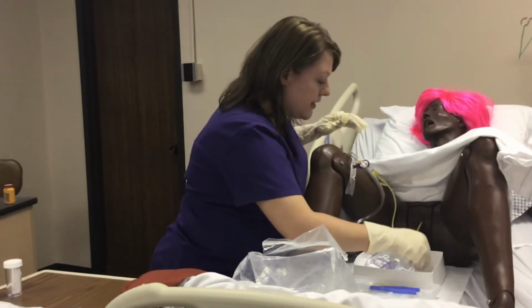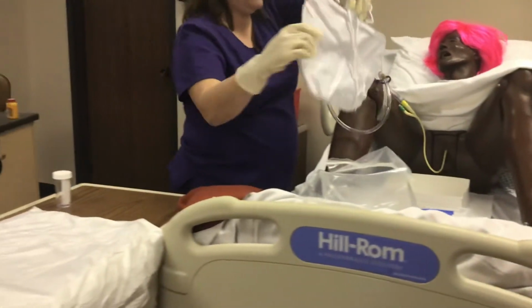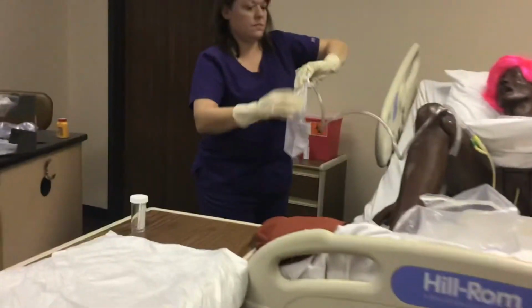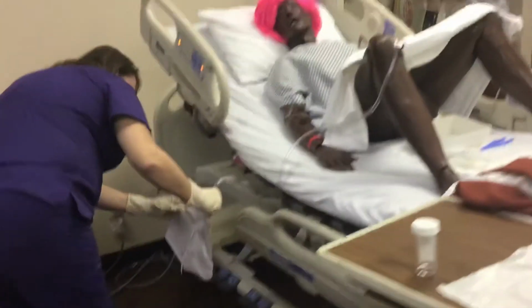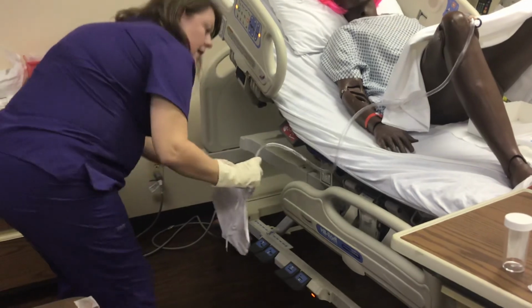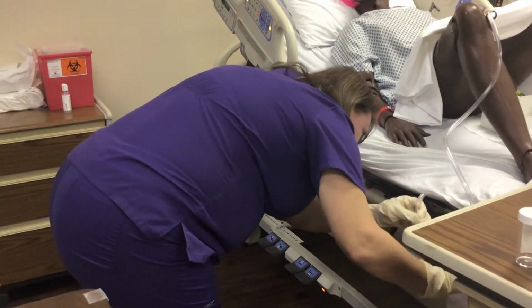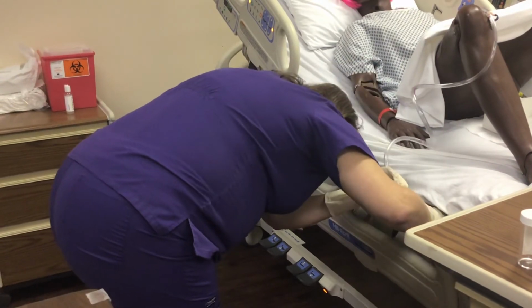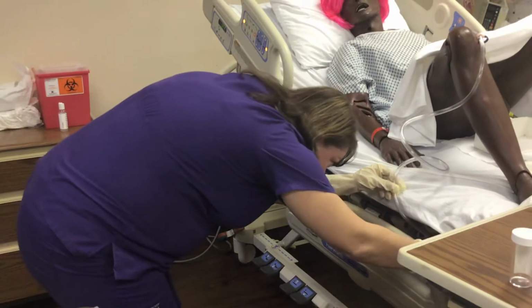She's got plenty of slack. Now I'm going to take the bag and I'm going to hook it on the non-moving part of the bed. There's a hook right here. So I'm going to hook it right there, okay?